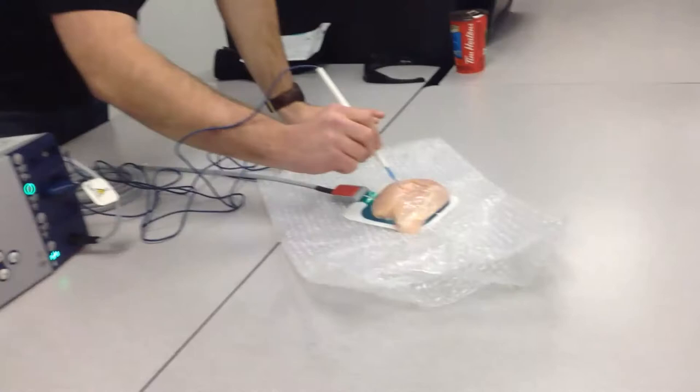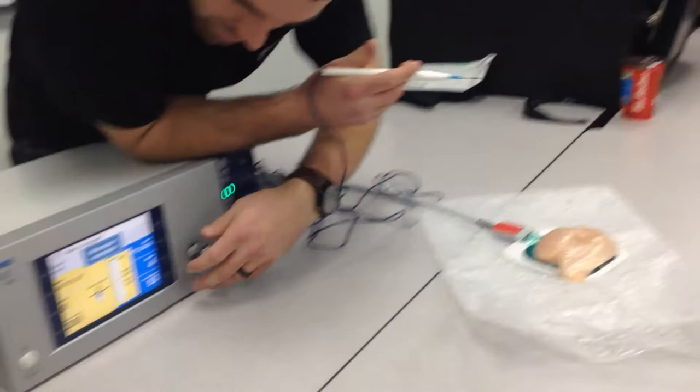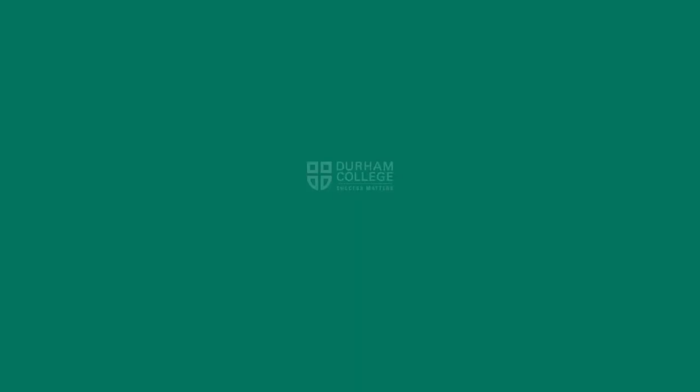I found it quite interesting — take a look and see what you think. On auto-cut, it's a lot easier. So you can see that effect, and then I'll change the effect as well. We'll go down to one, and you can see what the effect is. The watts are still at the same, but your effect is going to be a lot less — so you're not going to char as much skin around the side as the other one.